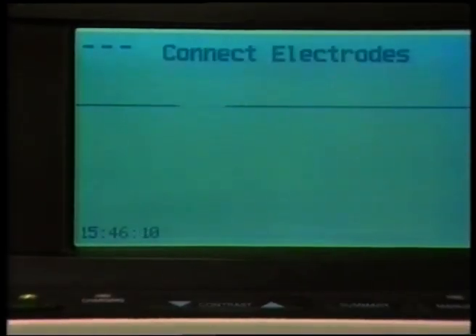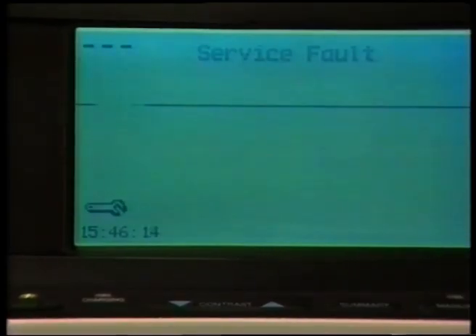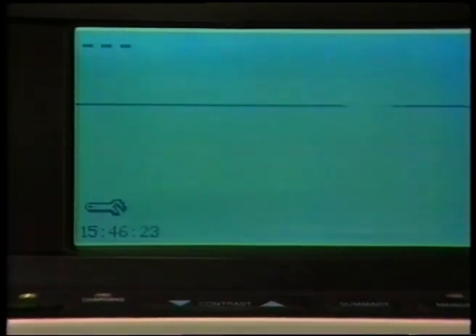The LIFEPAK 300 goes through a self-test procedure each time the device is turned on and after each defibrillator shock. If an internal fault is detected during this self-test, a service fault display message flashes twice, and a service symbol in the form of a wrench appears in the lower left corner of the display.